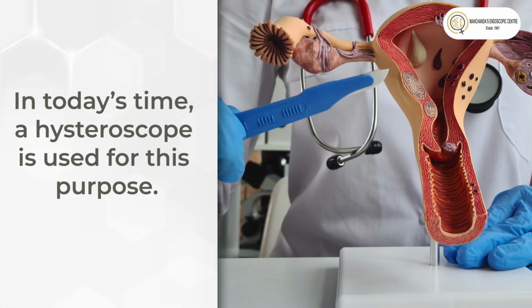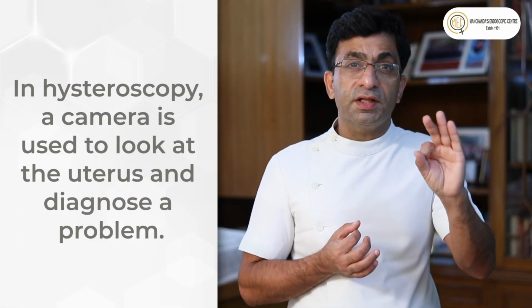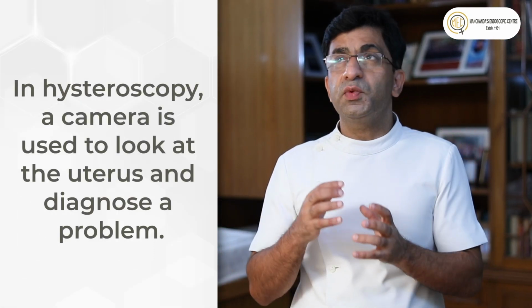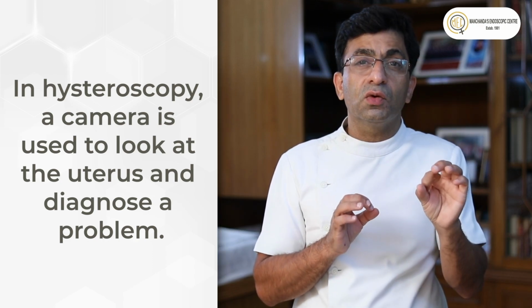Nowadays, for such problems, we have what is called a hysteroscope. It's a thin telescope, which goes through the vagina into the cervix, which is the neck of the womb or the neck of the uterus. We put a camera on top of it so that we can see on a big screen, without having to look from below, what is the problem inside the uterus.